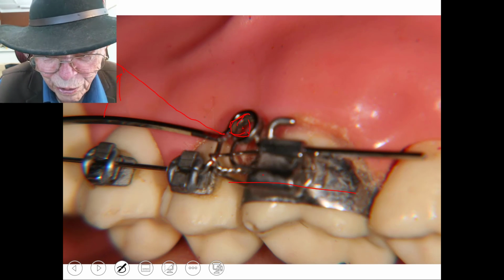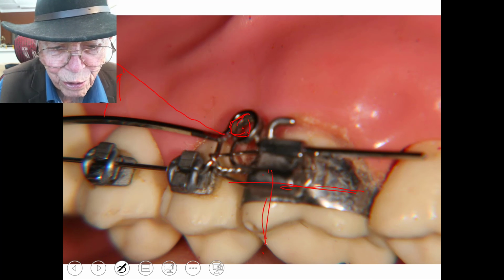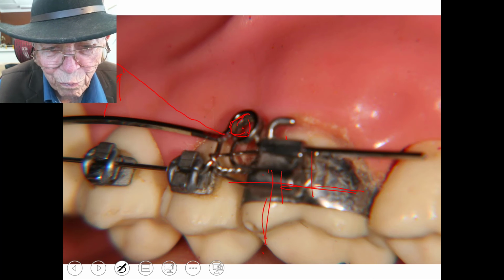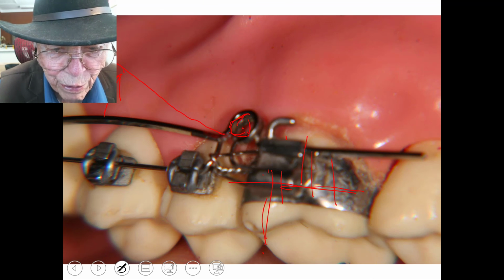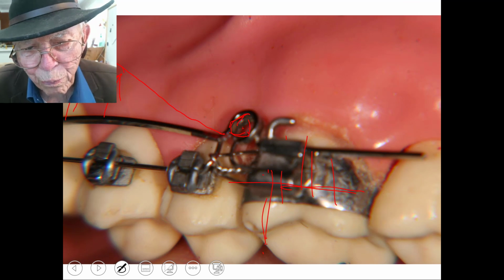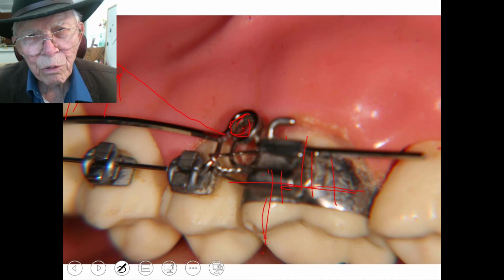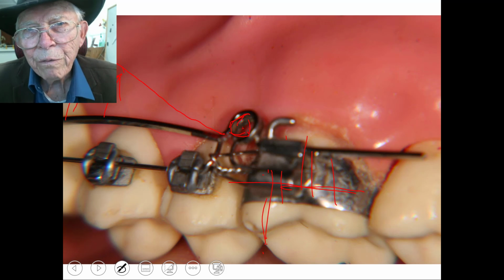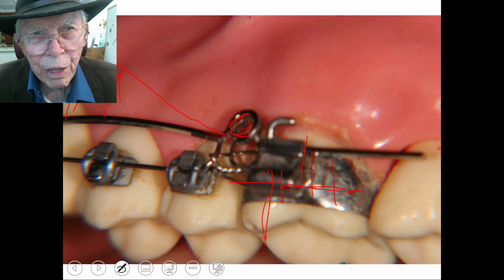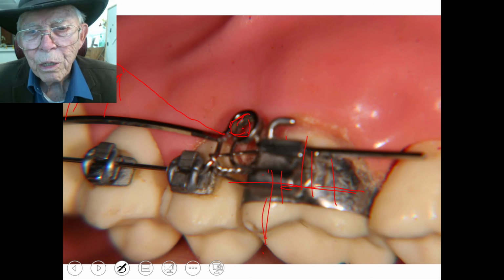And the force is on these 6-year molars, and you're biting one 6-year molar against the other. You'll have very little movement of this, but it's the same pressure back here as it is up in the front part of the mouth. I hope you understand this concept, because it really works. I have never found a case that we could not level the bite regardless of their age, as long as I didn't have any ankylosed teeth to mess with.